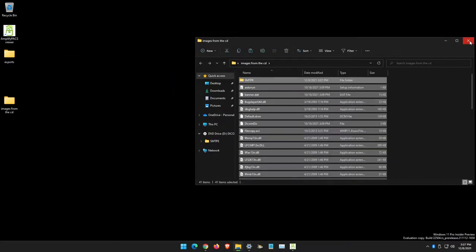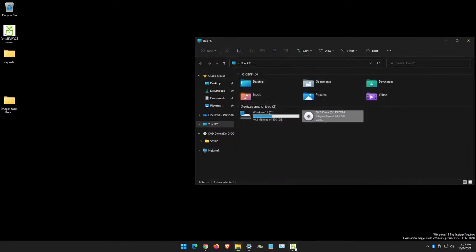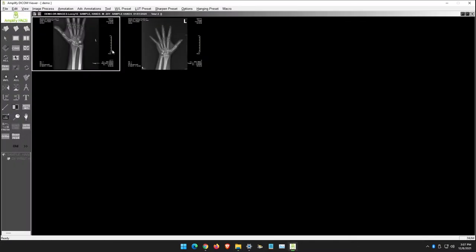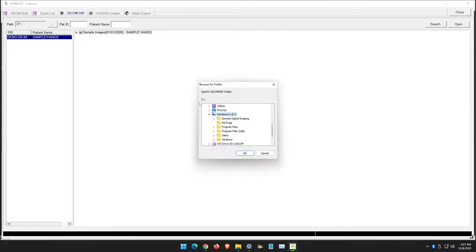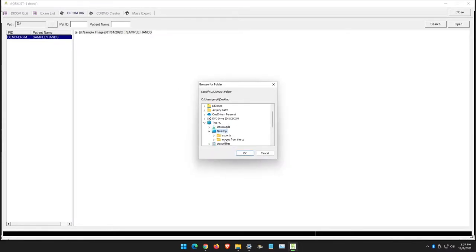That way I can have a local copy of the images on my local disk. If I ever need to access them, I can go back to the AmplifyPAX exam list under DICOM directory and change that path to my desktop, images from the CD.